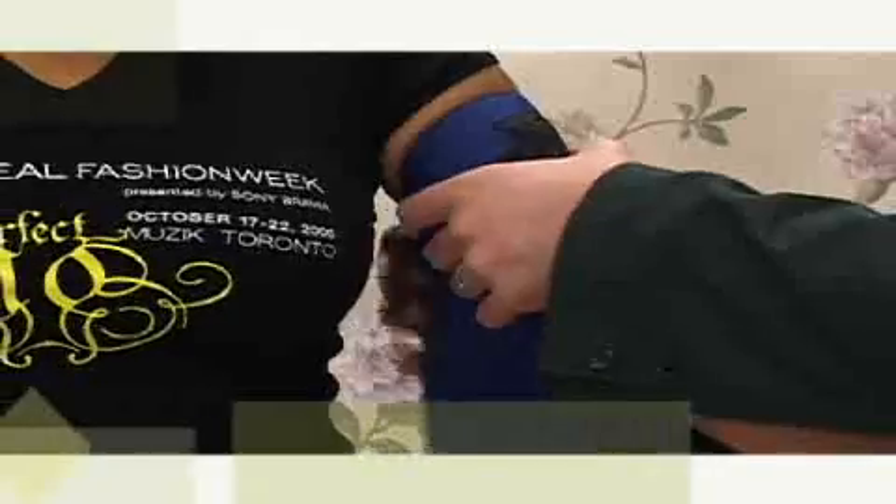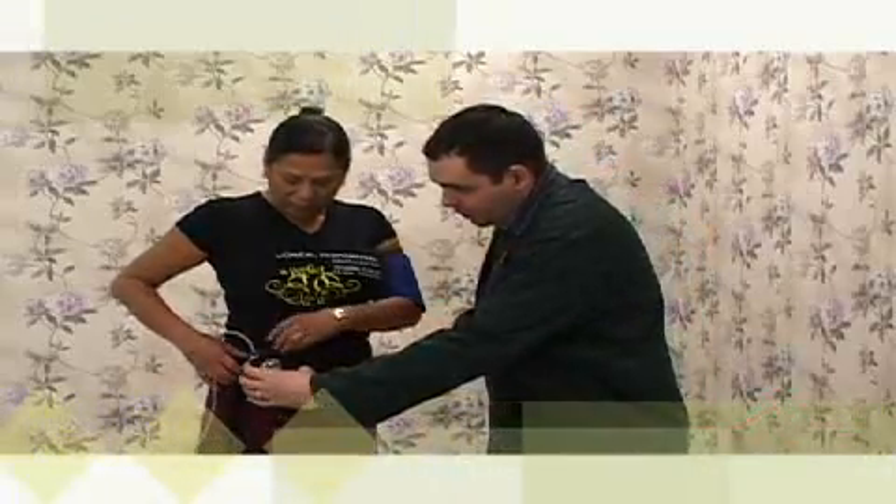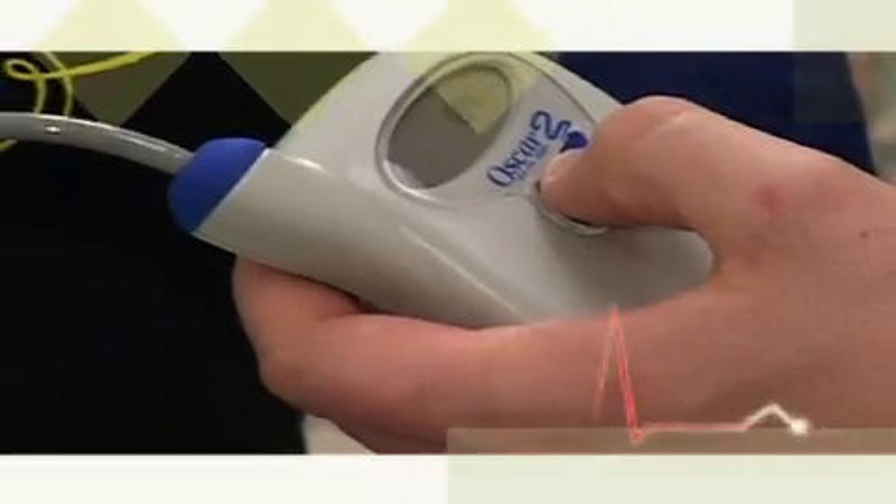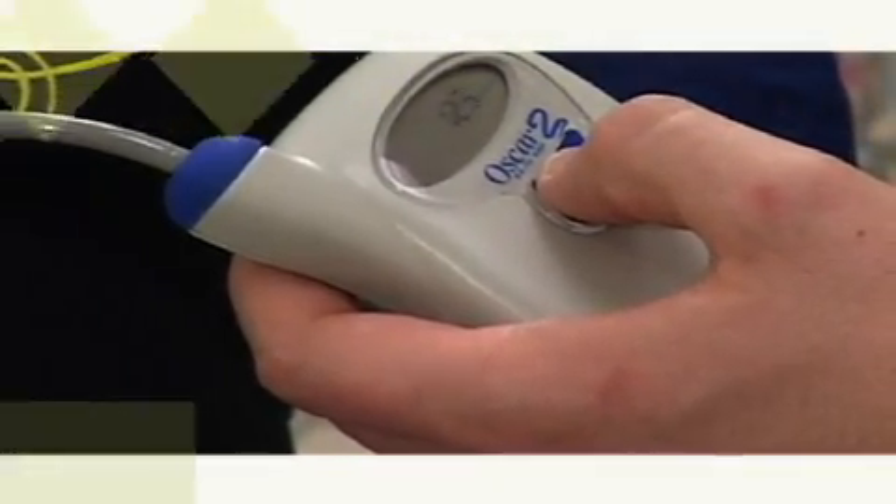The blood pressure cuff will be placed on your upper arm and the recording device secured around your waist. The technologist will begin the recording and ensure that the monitor is working properly. You will receive a booklet to write down any symptoms you have during the monitoring period.